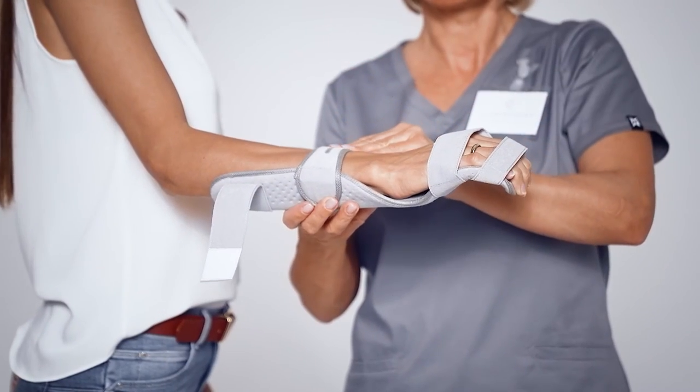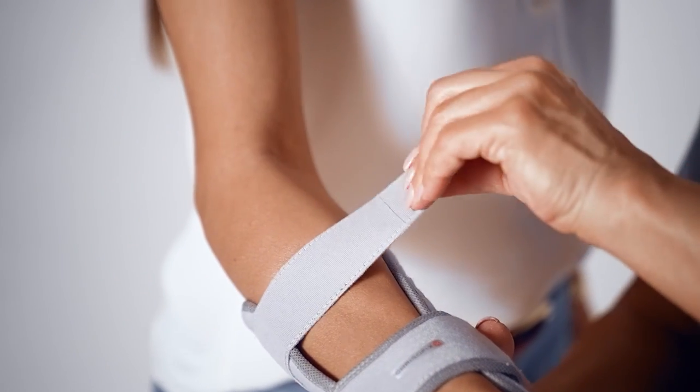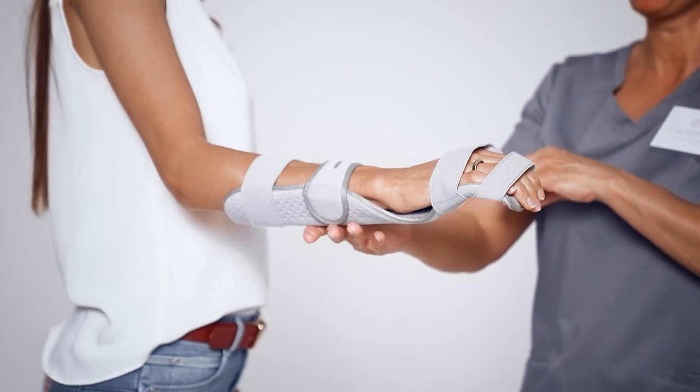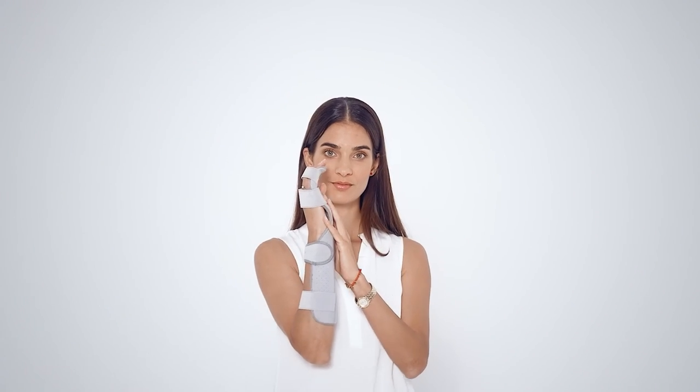Thanks to the special, innovative structure of the Chrysofix universal wrist orthosis with an aluminium core that makes up the frame of the orthosis, it provides adequate stability while maintaining the opportunity for precise and exact fitting.